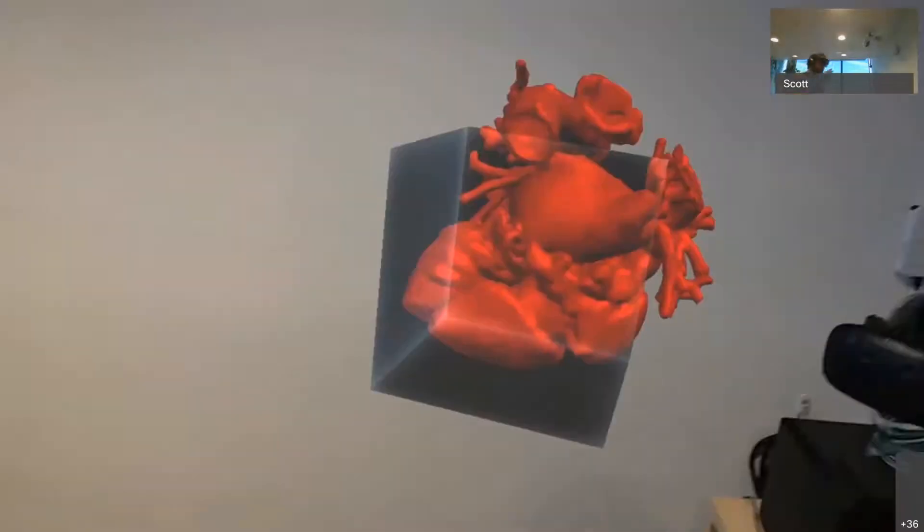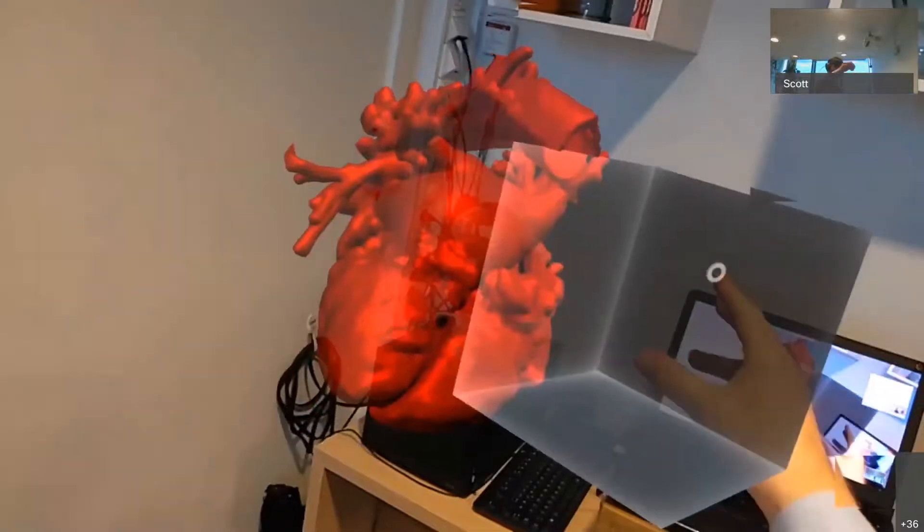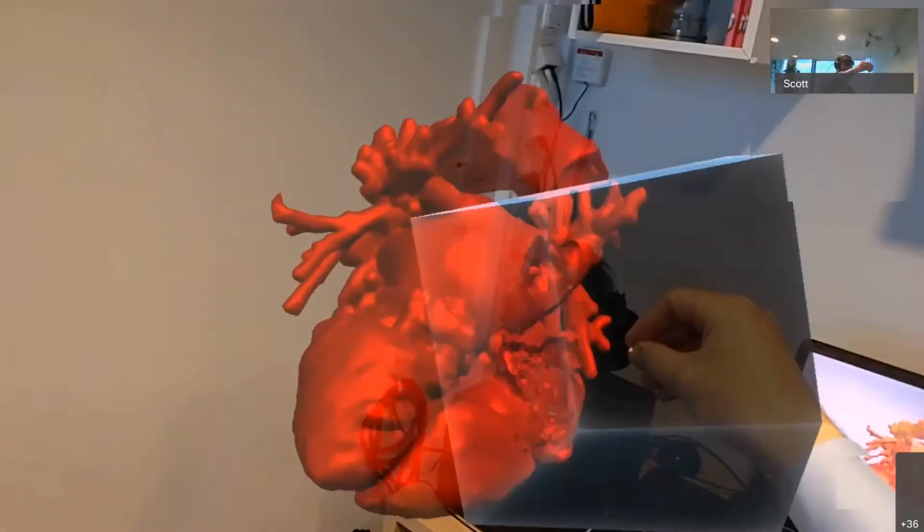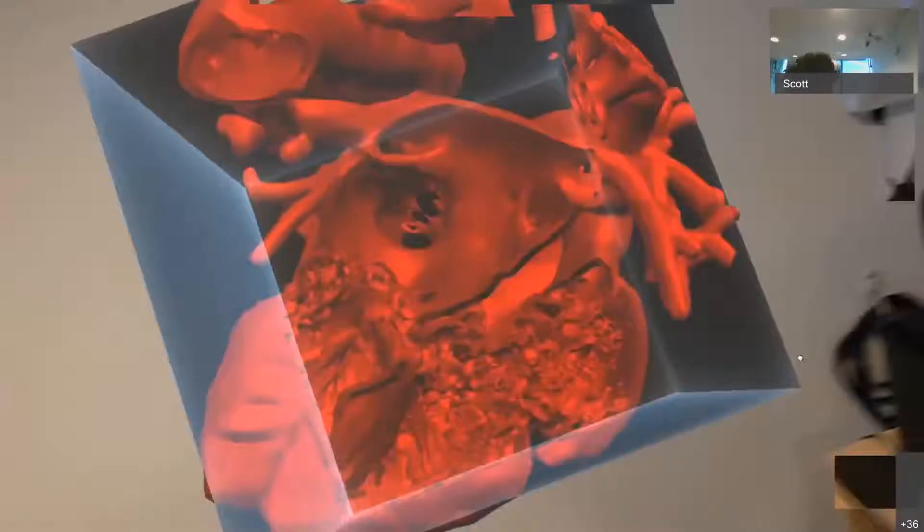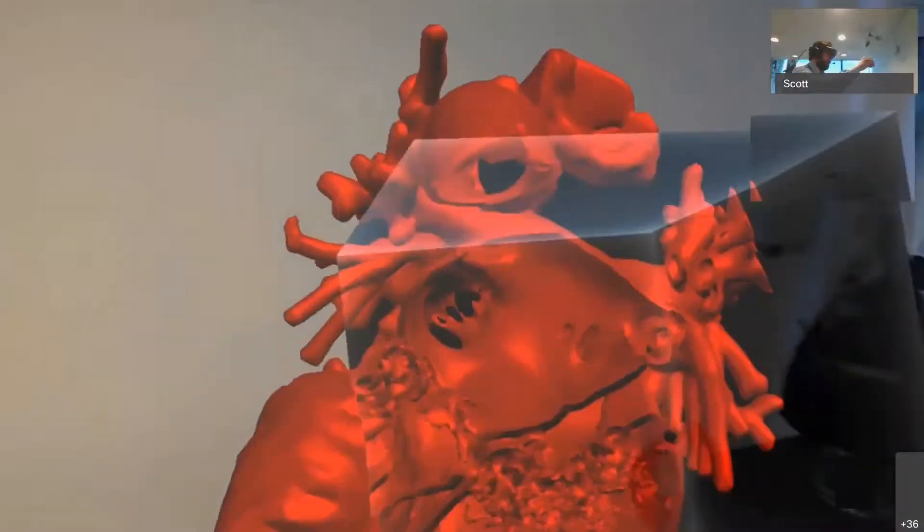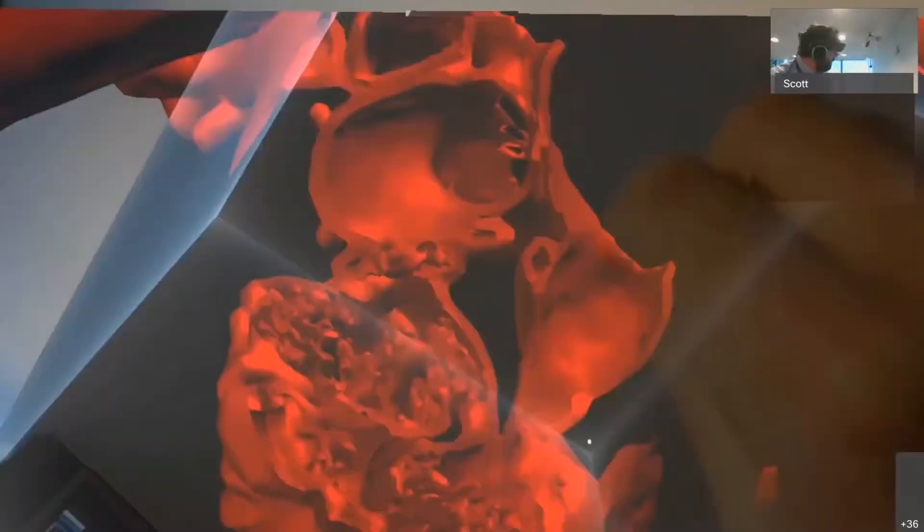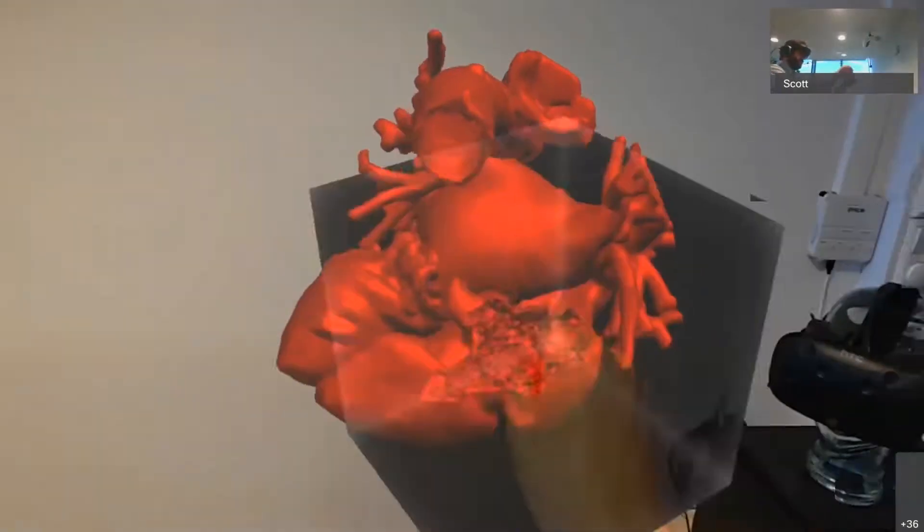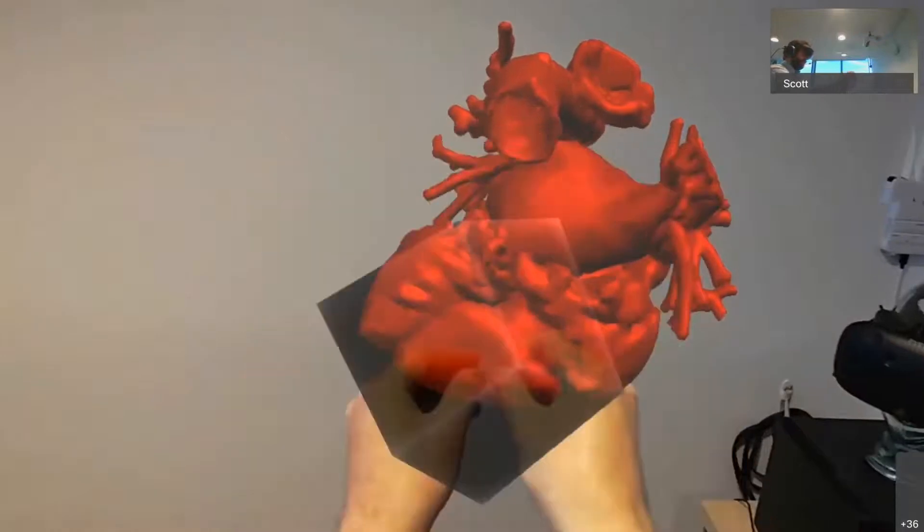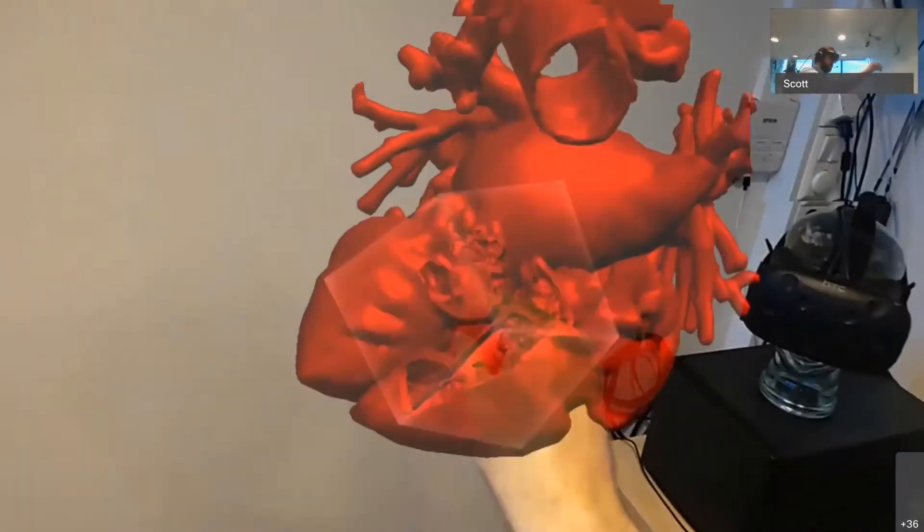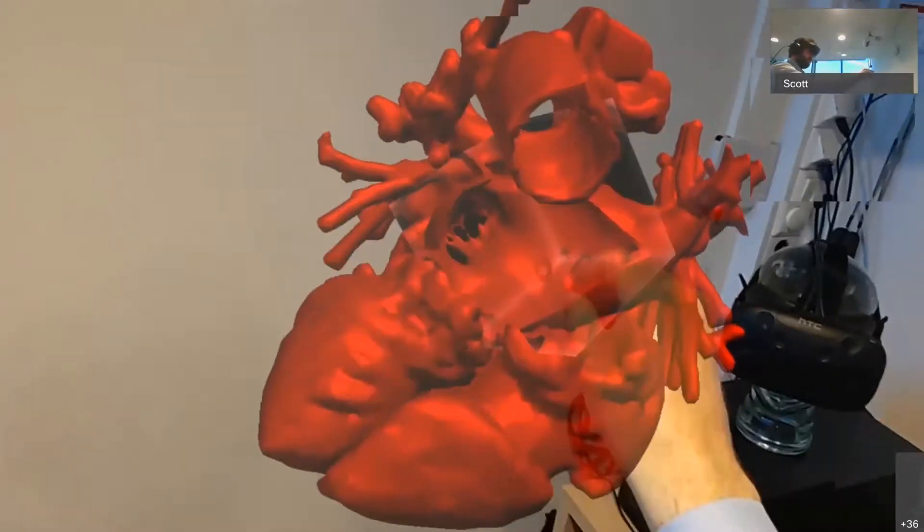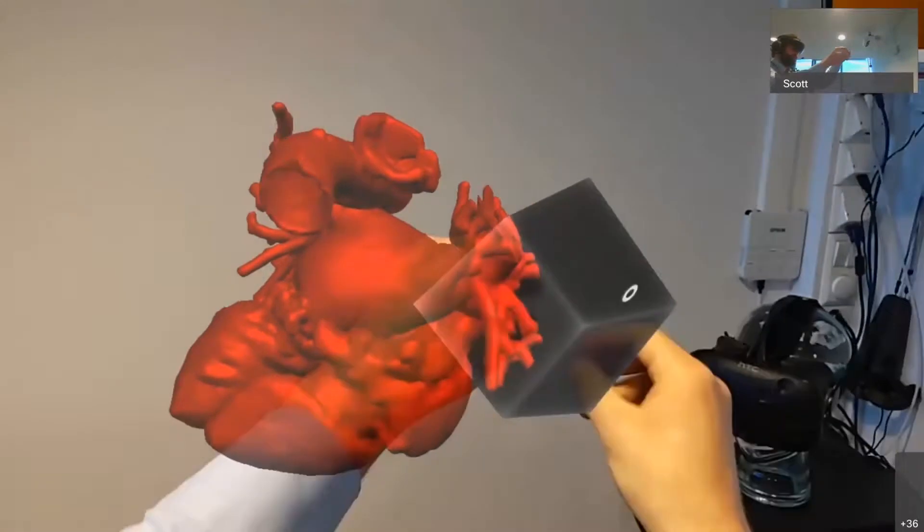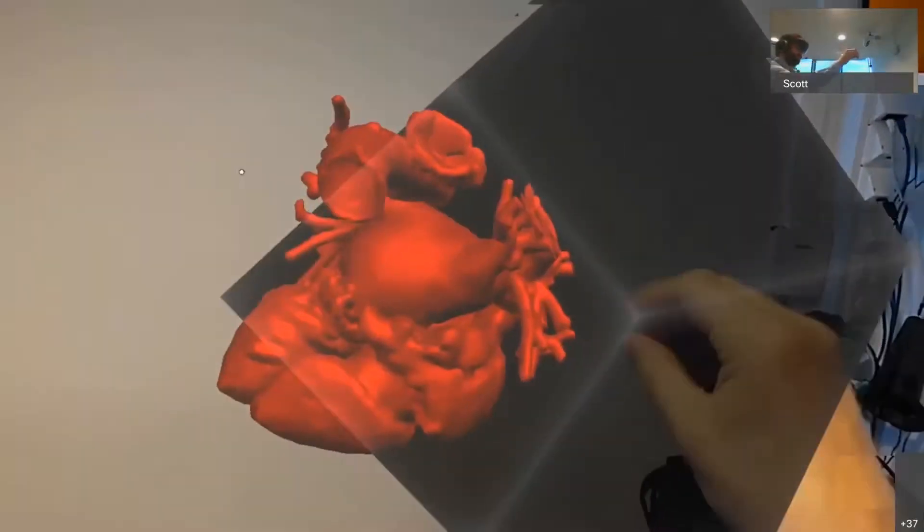And this gives me this slice tool here, this cube, that I can push inside the heart to see internal structures of the heart. I can slice in from different angles. And I can also resize this slicing tool to make it smaller or larger.